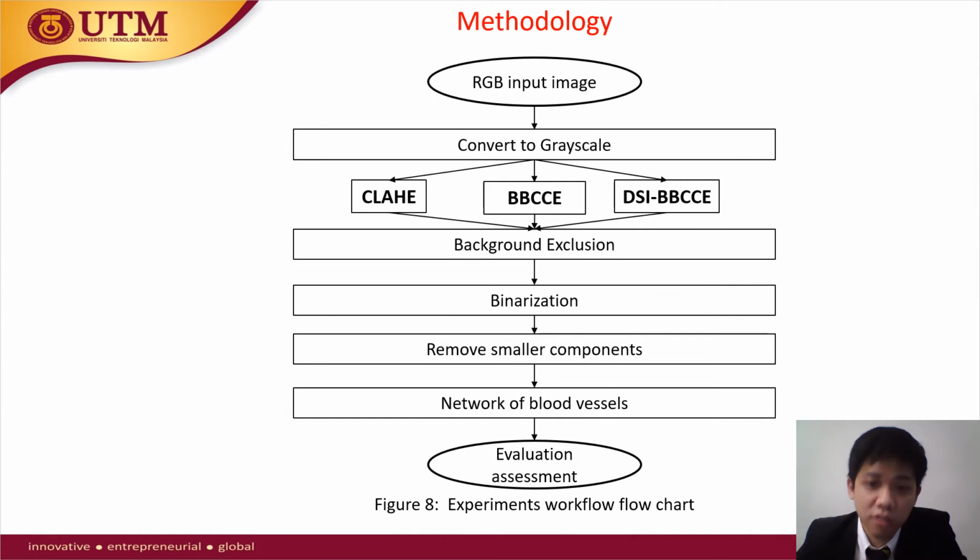This is the methodology flowchart. There are three different experiments of contrast enhancement, which are CLAHE, BBCCE, and DSI-BBCCE. After we get the blood vessel segmentation, we evaluate the assessment to see the accuracy of the segmentation.